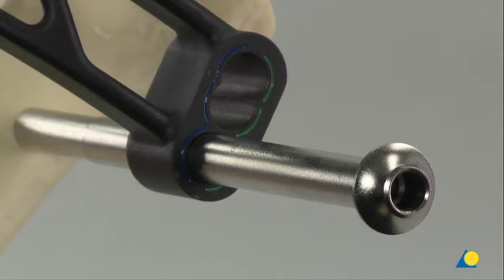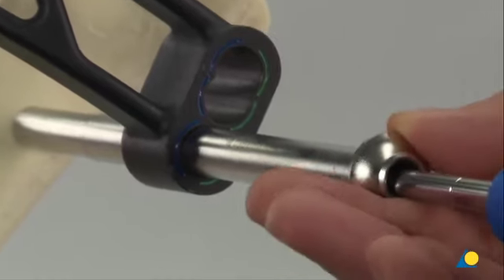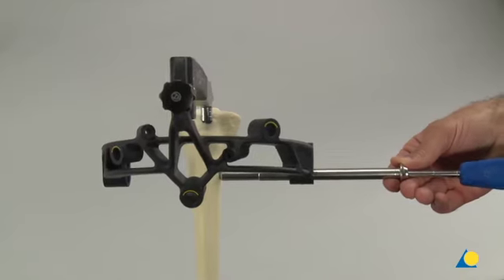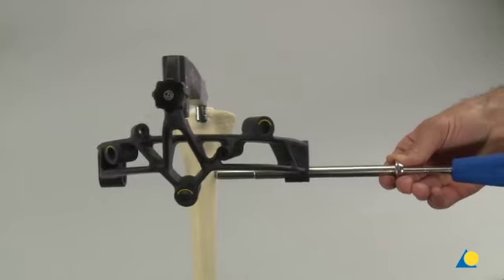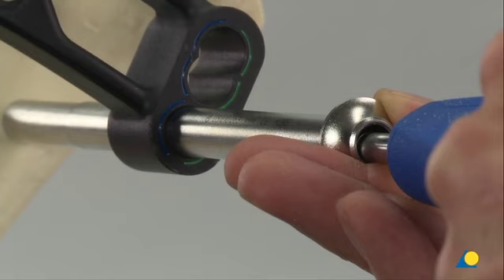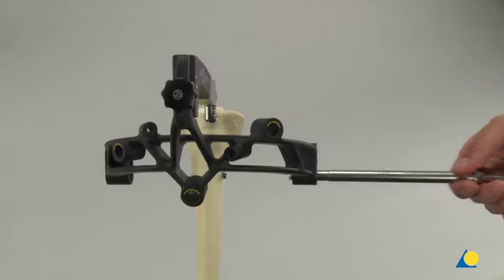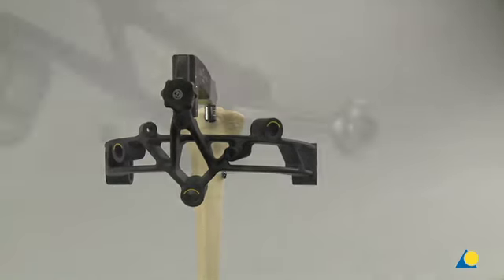The 4.0 locking screw is inserted through the protection sleeve and threaded into the hole with the screwdriver star drive T25. The screw length is verified under image intensification. The tip of the locking screw should not project more than 1 to 2 mm beyond the far cortex. After the length of the screw has been verified, the screwdriver and protection sleeve are removed.